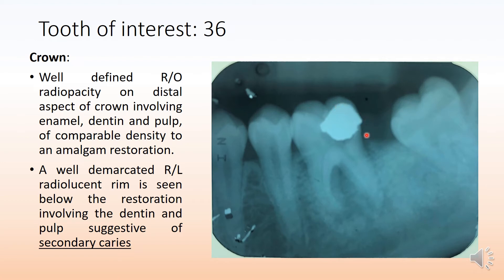There is a well-defined radiopacity on the distal aspect of the crown involving enamel, dentine, and definitely involving the pulp of the tooth, because it is a large radiopacity with density comparable to that of an amalgam restoration — it looks very dense and has to be an amalgam. You also see a well-demarcated radiolucent rim below the restoration, indicated by the orange arrow marks, involving the dentine as well as the pulp, which is suggestive of secondary caries involving the pulp.